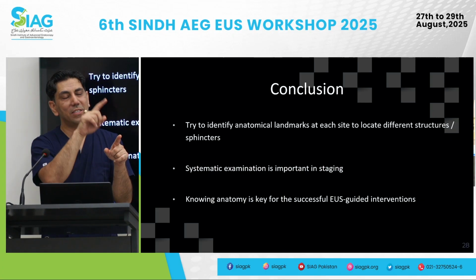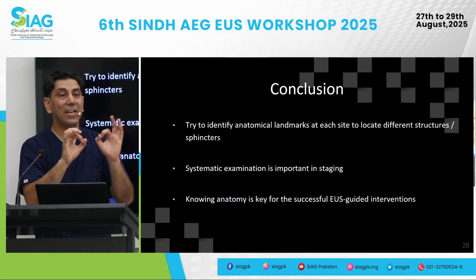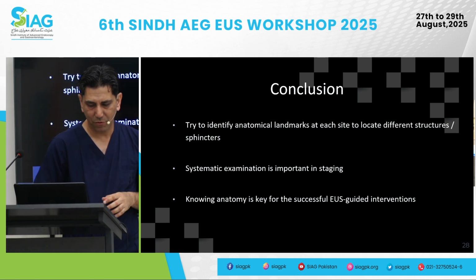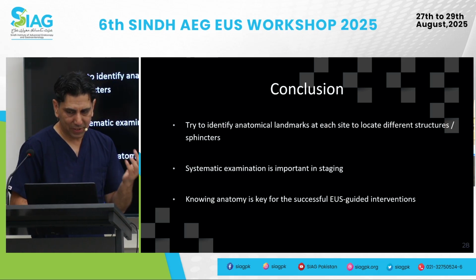And in the male patient, the prostate appears like a kidney with a cortex and medulla, when it does not actually have a cortex and medulla. Okay, so that's a very brief way of doing it. Let's just see the live demonstration that may help us to understand further.